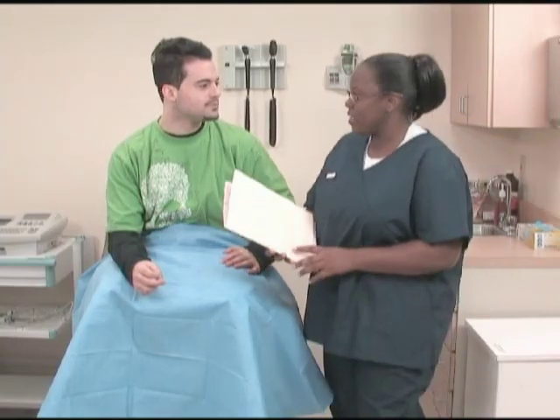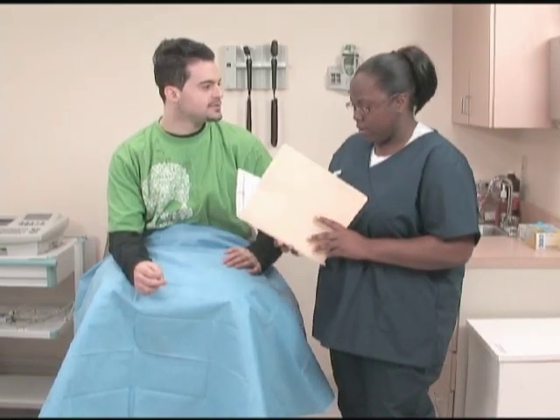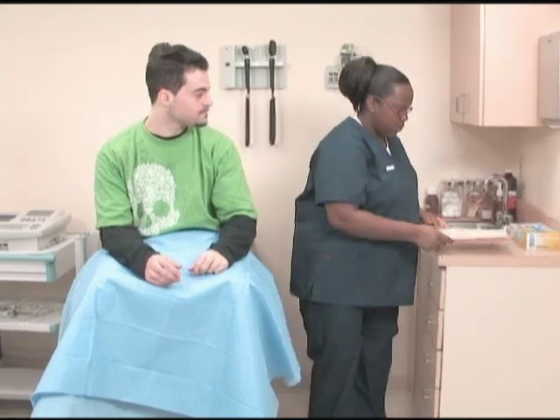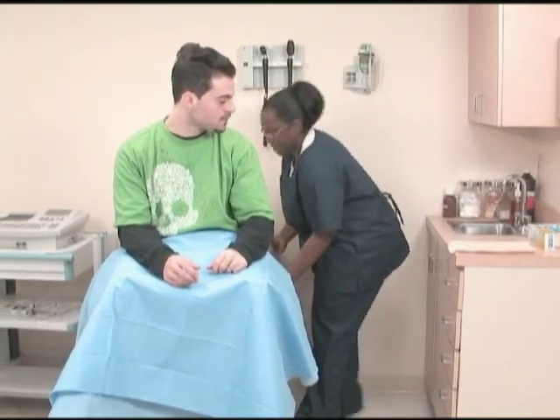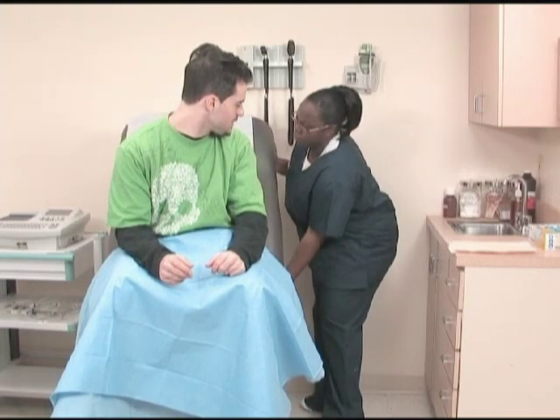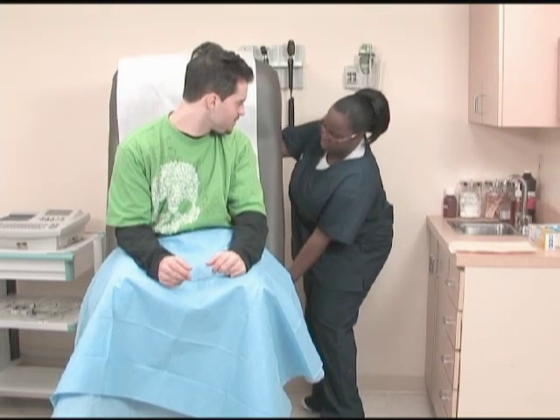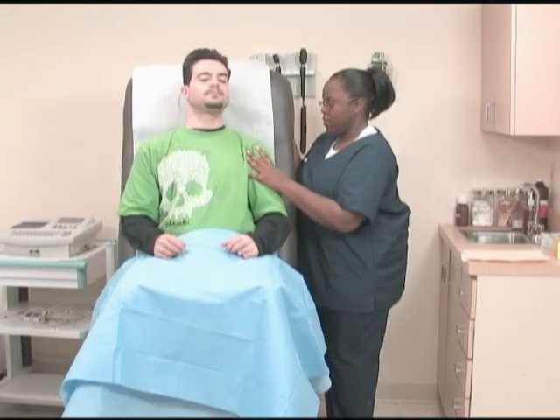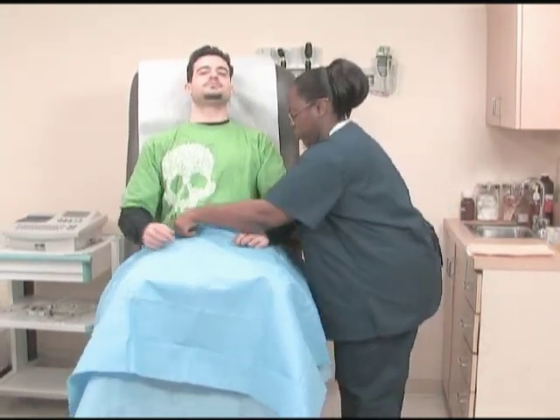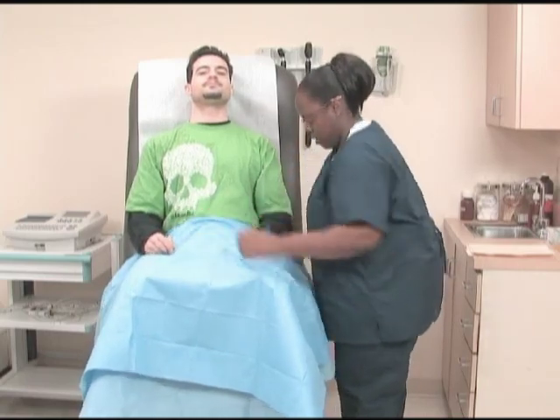Identify the patient and verify the physician's orders. Explain the procedure to the patient. Assist the patient into a comfortable position. The patient should be comfortable to avoid having to shift during the lengthy casting process.